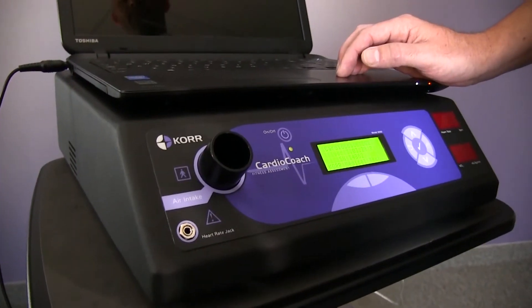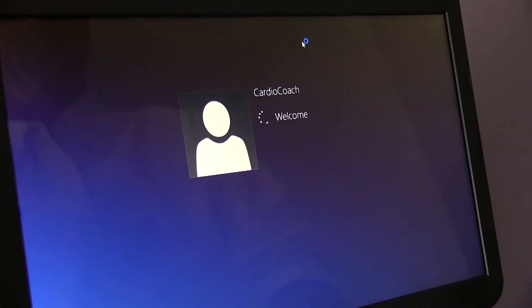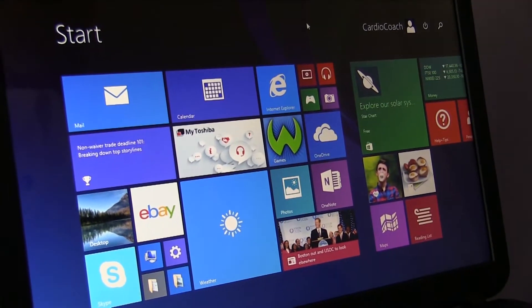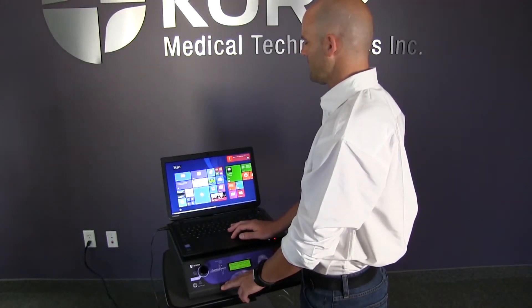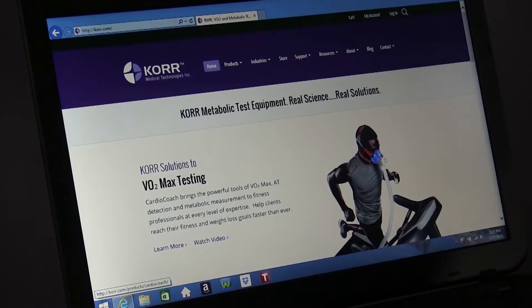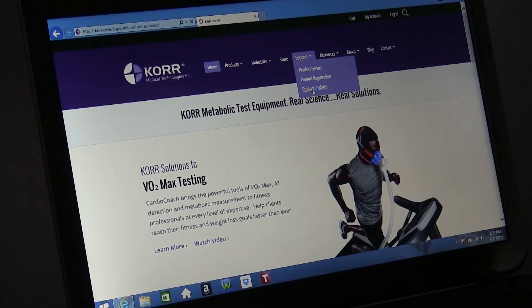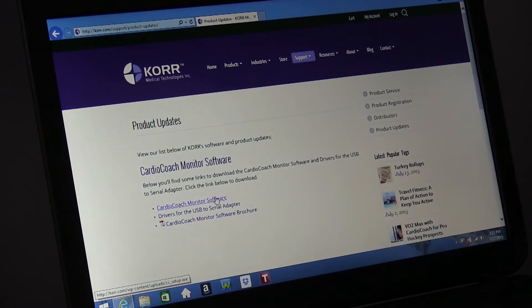Power on your CardioCoach as well as your computer. If you purchased a laptop from Core and it prompts you for a login and password, simply hit Enter to log on. All CardioCoach monitor software and USB adapter drivers have been pre-installed on laptops purchased from Core. But if you plan to use your own laptop, you will need to download and install the software. To do this, visit core.com, click on Support, then click on Product Updates to get links to the most up-to-date versions of the software.